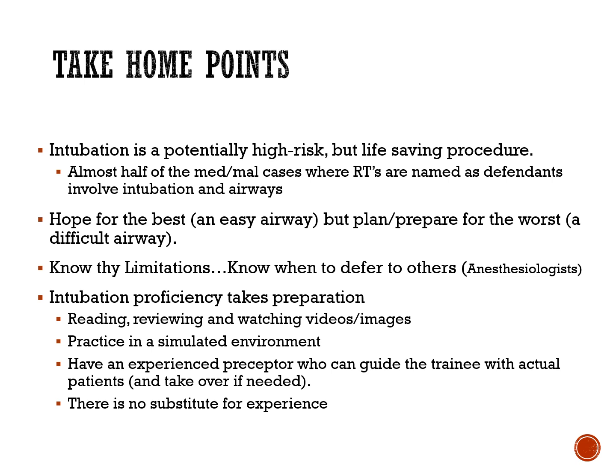We'll look together, and if it looks pretty straightforward, I will guide them. I will hand the laryngoscope over to them, assuming the patient is maintaining their SATs and it's not a crisis situation, and we'll do it together. Or I will hand everything off to them and just guide them through it gently. Do a few like that, and then build up their confidence and their experience.